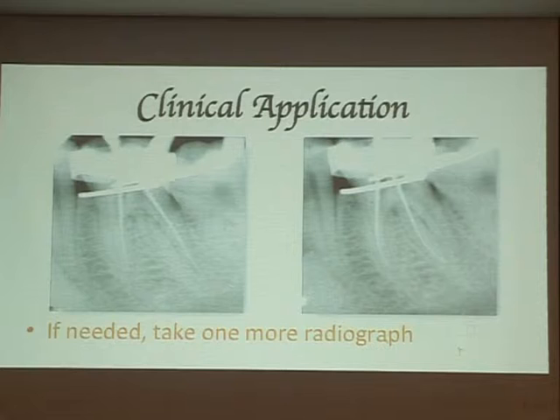Or if you still struggle, put one file on each side. This is mesiobuccal, distobuccal, mesiolingual, distolingual. So your life is less stressful.